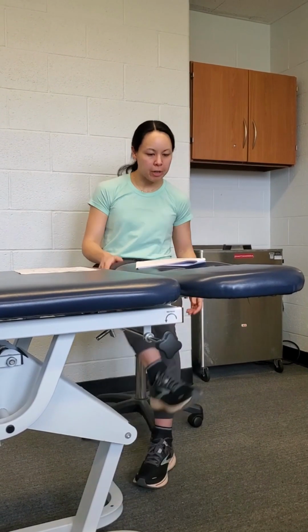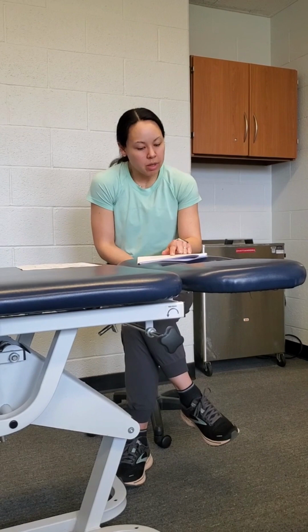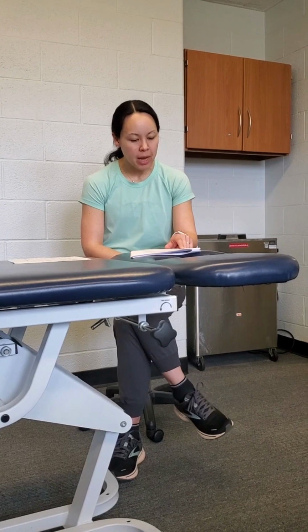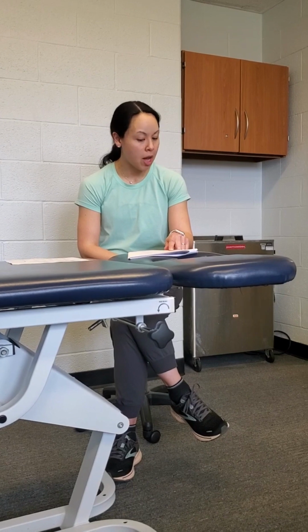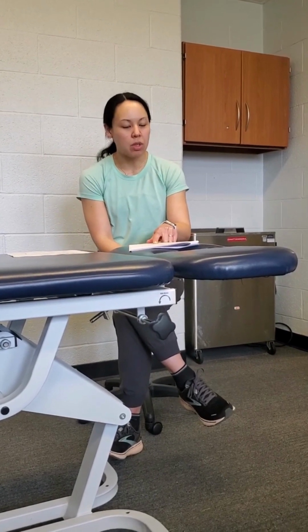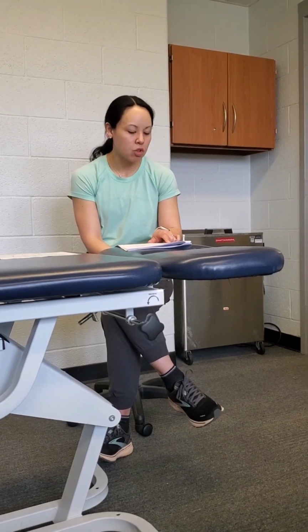So for passive BFR, like I said, it's early post-op or post-injury. You just let the tourniquet do the work. The pressure is going to be about 70 to even 100% limb occlusion pressure, and the protocol for that is 3 to 5 bouts of 5 minutes on, so the cuff is on, and then 3 to 5 minutes off. So it's the same ratio of the machine working to the rest when it's turned off. And this is probably not going to be realistic for us, but the goal is to do it 1 to 2 times per day. So it's as many times as you can, essentially, with those post-op patients, or if the patient's coming in post-injury.